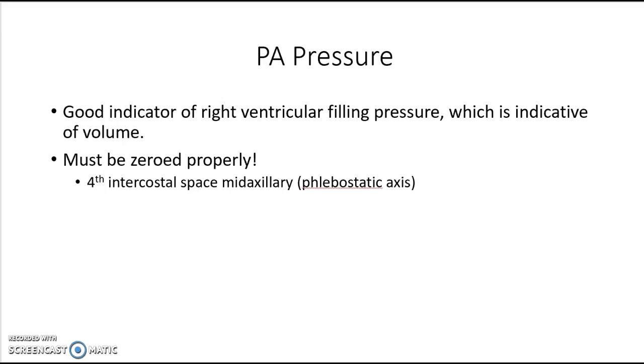Okay, PA pressure is a good indicator of right ventricular filling pressure, which is indicative of volume. Now remember, the system has to be zeroed appropriately. The transducer has to be centered at the fourth intercostal space, or the phlebostatic axis.